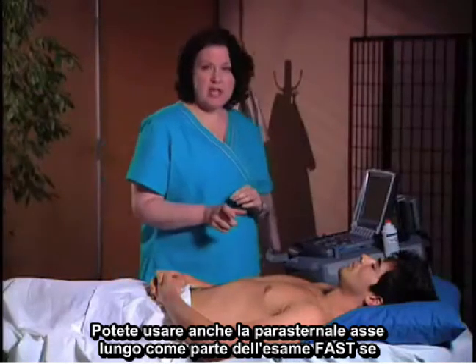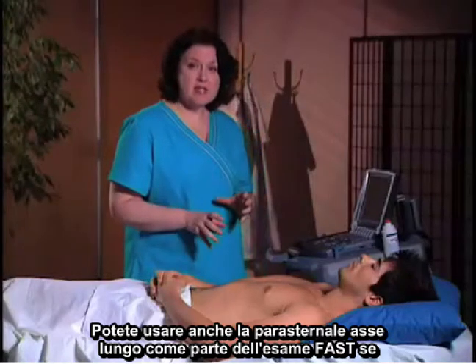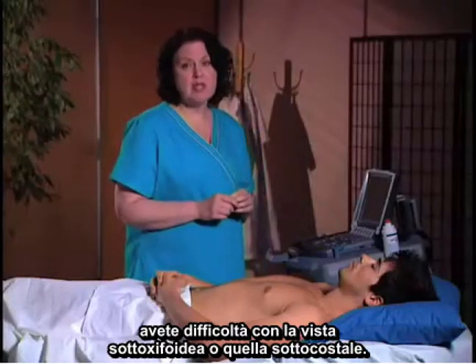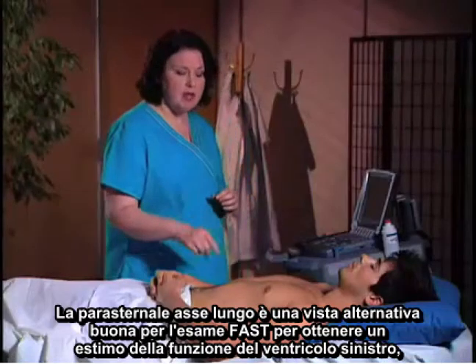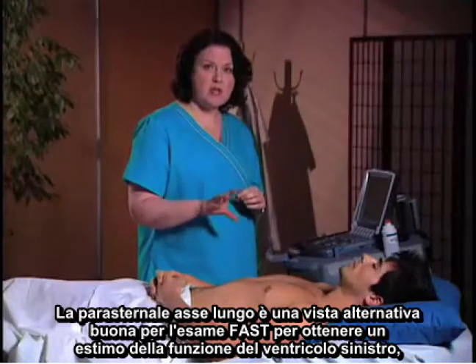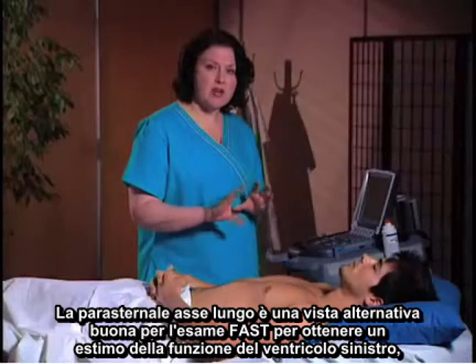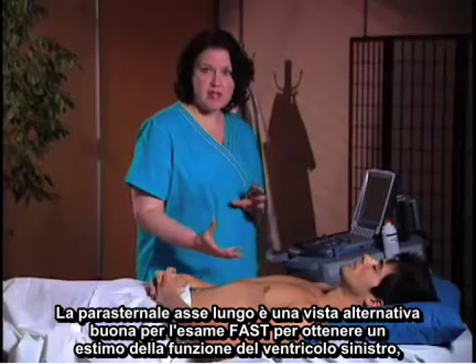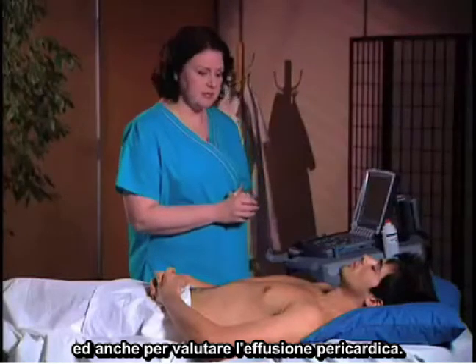The parasternal long axis can also be used as part of your FAST examination if you're having trouble doing the subcostal or subxiphoid view. It's a great alternative to get an overall estimation of left ventricular function as part of the FAST exam, and to evaluate for pericardial effusion.